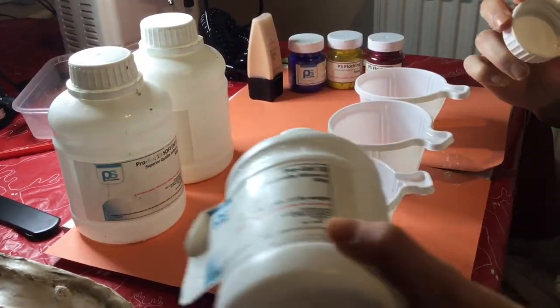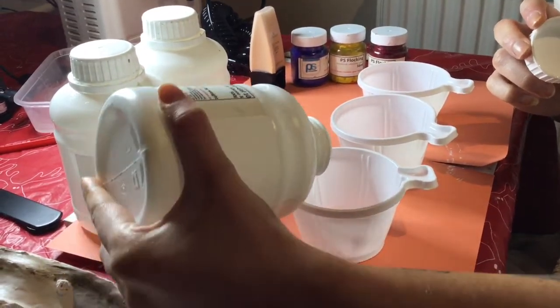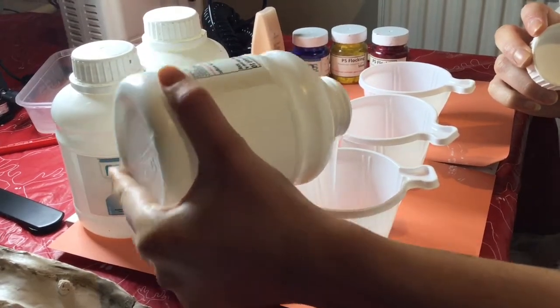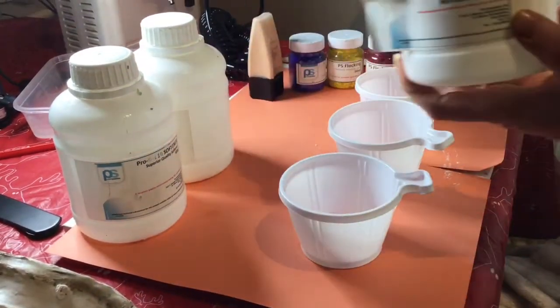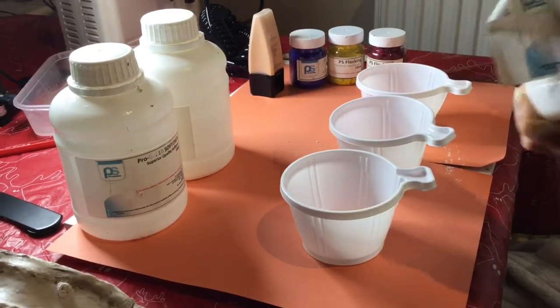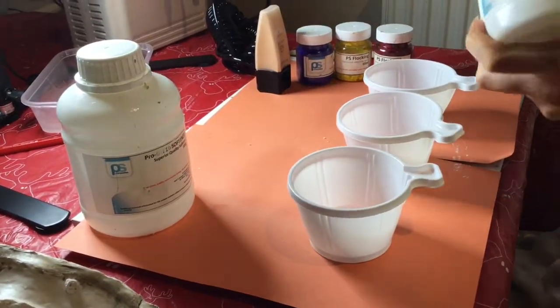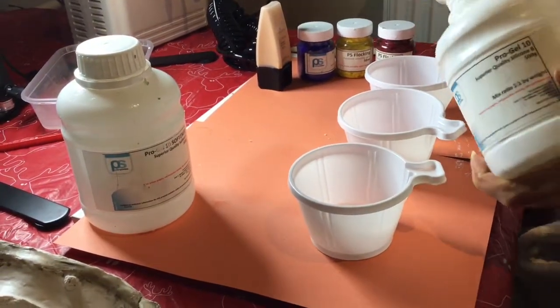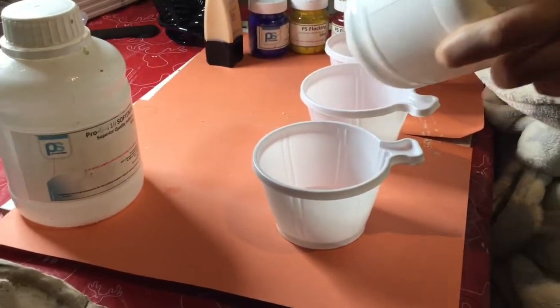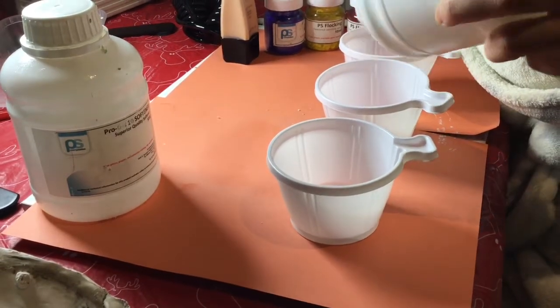Once the encapsulator had dried, I began to mix my silicone. In separate bowls, I weighed out equal parts of component A, B and the softener. It was important to weigh the silicone components out separately because as soon as they are mixed together, they begin to cure. Once all of the components had been weighed out to equal amounts, I began to add my pigment and flock into component A and mixed it all together. I did this because if I made a mistake when mixing the pigment, it meant only one component would be wasted rather than all of them, which would save me time and money.